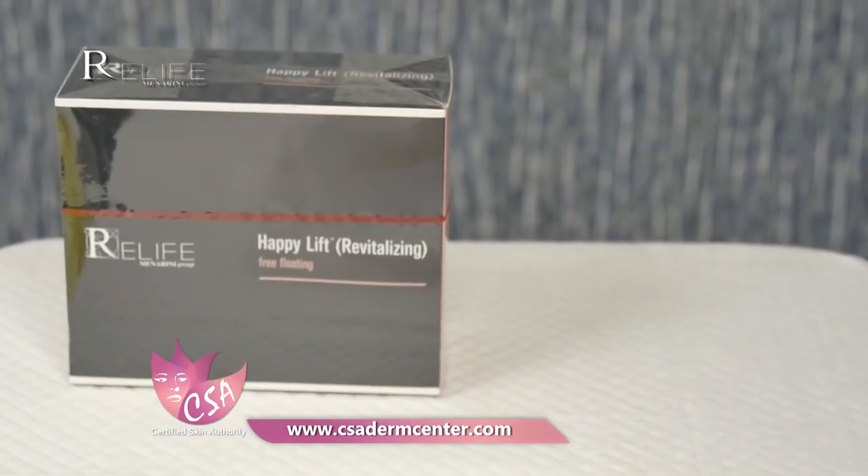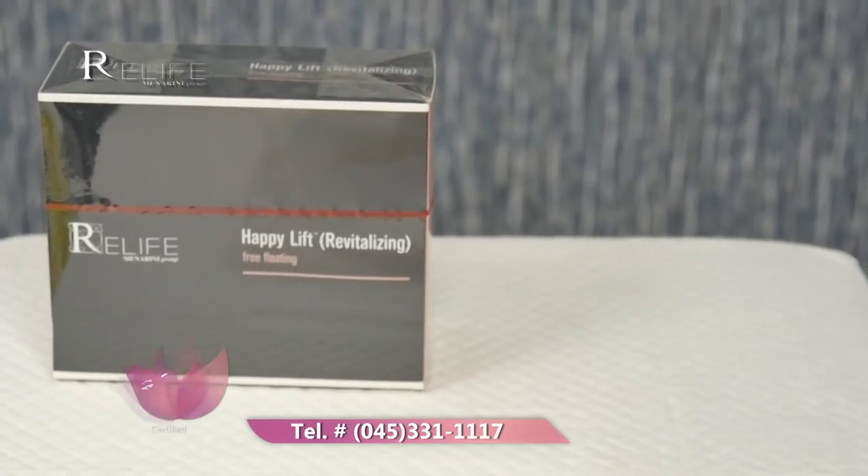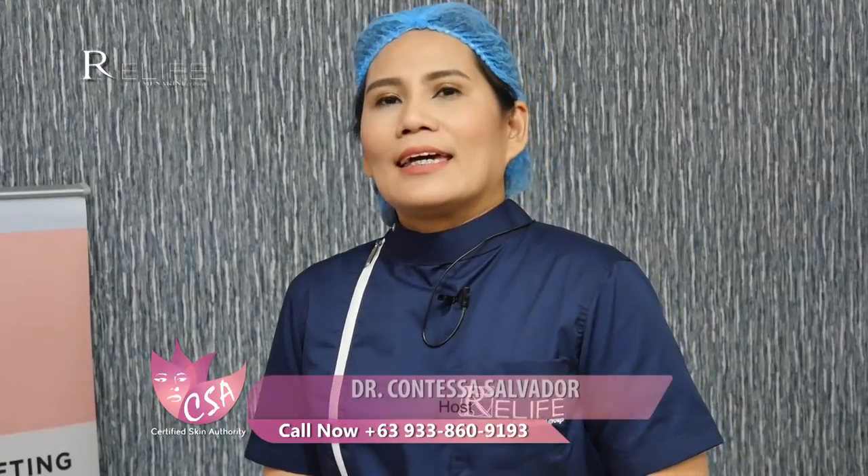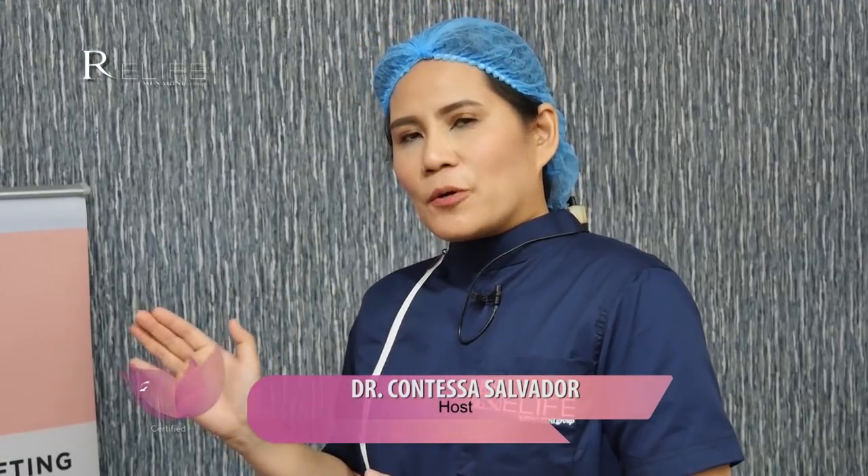We're going to show you the actual procedure on the so-called Happy Lift threads. These are revitalizing barbed threads that are absorbable, and the threads are from Italy.